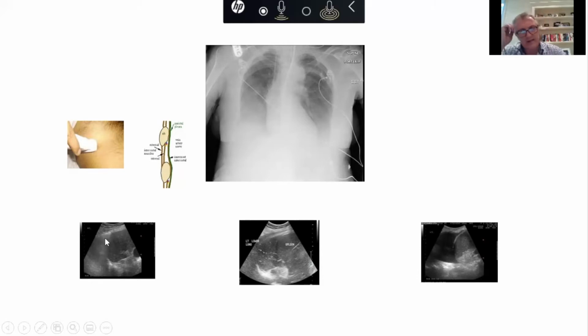Now, many years ago, when ultrasound was evolving, there was so much interest in the liver, biliary tree, and abdomen that they really thought that lung ultrasound was of no use whatsoever, because lung contains air, and air is highly reflective, and therefore no image could be seen. But what became quite apparent about 20 years ago, even probably longer than that, is that when lung is abnormal, it becomes replaced either with fluid or becomes solid. So here we have no image because of air in normal lung.